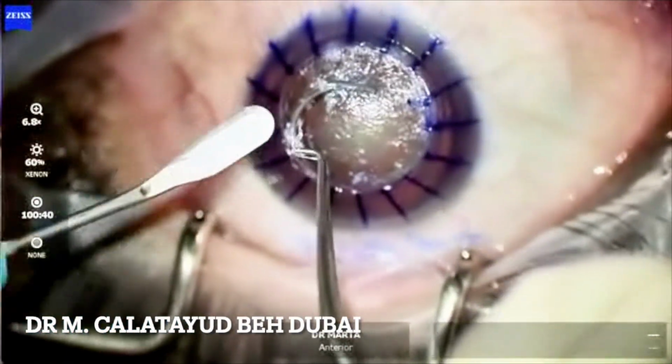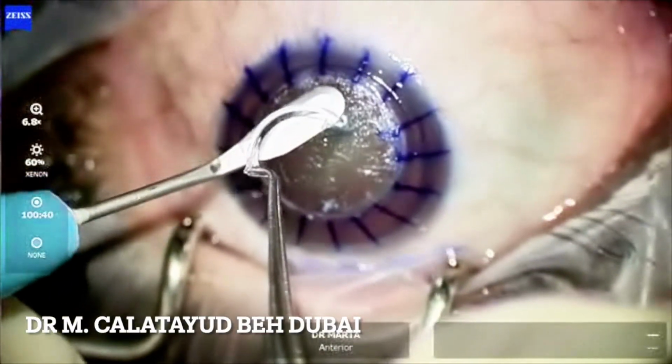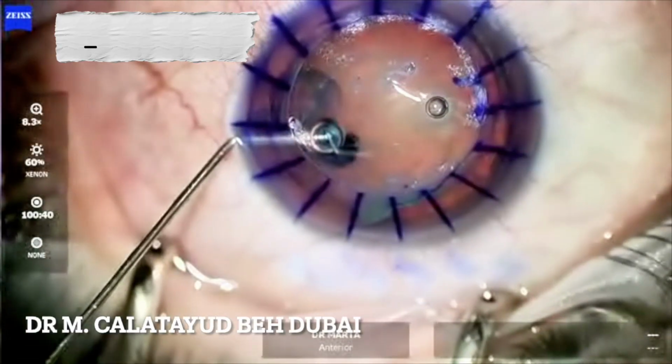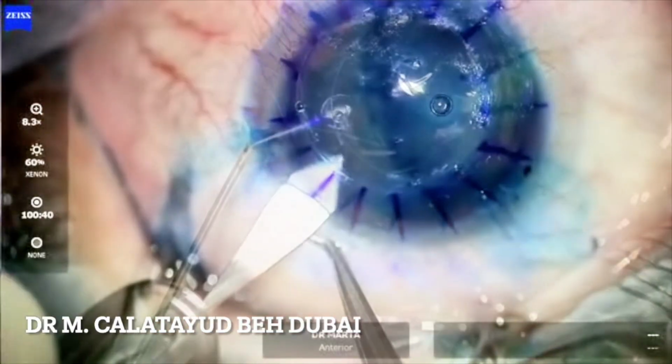surrounding the ring. We make a dome with HPMC over the stroma to improve visibility and proceed to inject trypan blue to perform a correct capsular rhexis. This is a key moment in the surgery which can change completely the procedure.